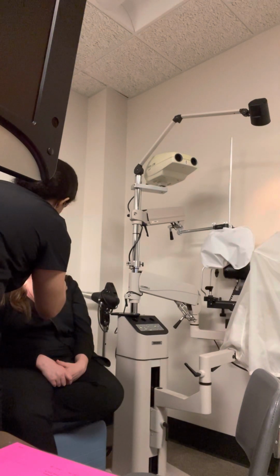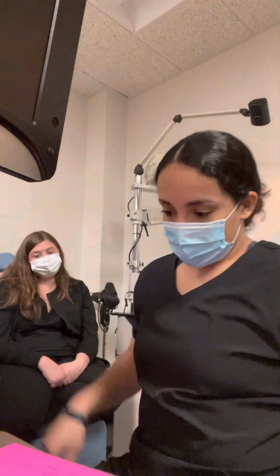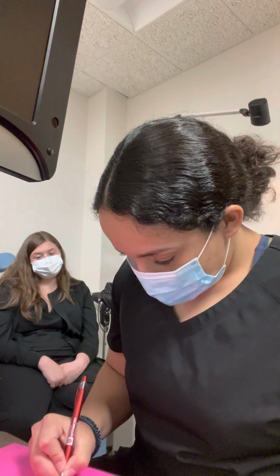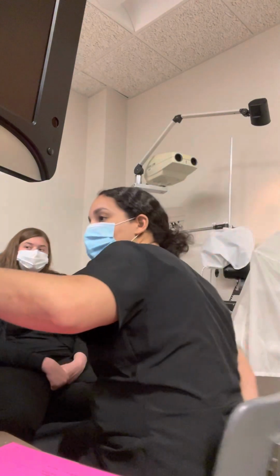It's your big distance target there. Okay. Just tell me what you see in that box, okay? Okay, awesome. And this O is a near target. Okay, she has a speed of 4 for her direct and consensual responses in both her right and left eye. Big A, little O. Alrighty, Mrs. Barber, and last thing but not least.